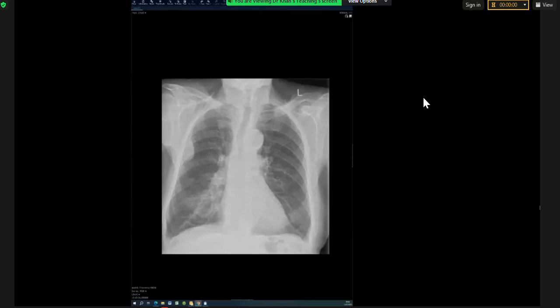Yeah, you would. But that's a discussion for the VIVA. Commonly, is myeloma more common? Fibrous dysplasia, you tend to get asked for more for pelvic bones, or it's a more heterogeneous appearance. But obviously, anything can look like anything. On this last case, why could this not?